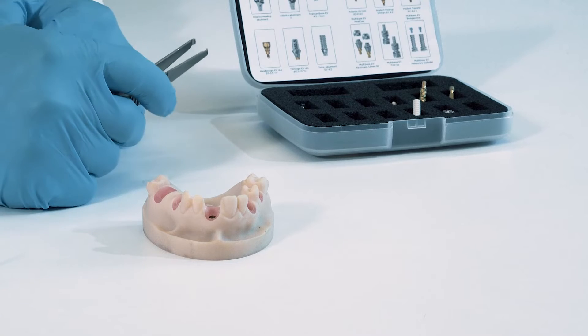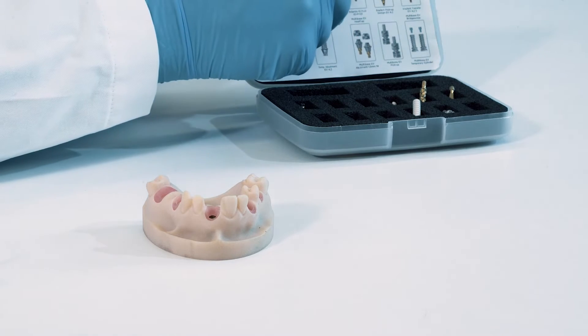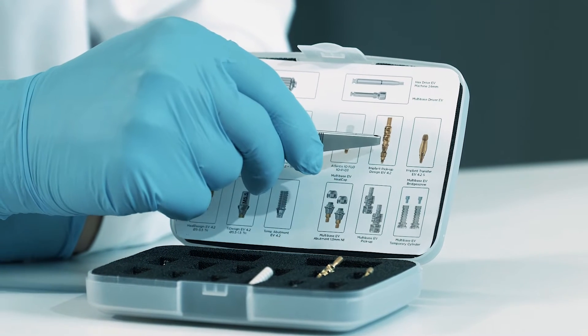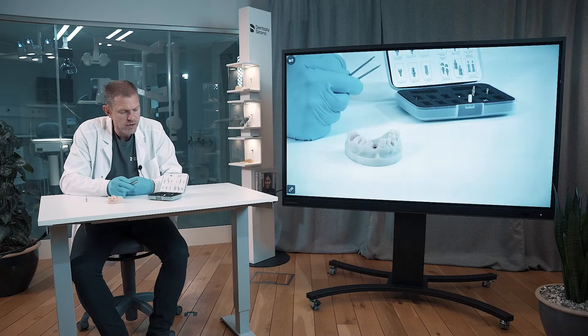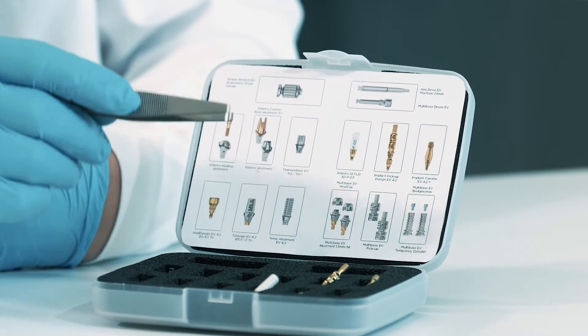The impression components in this box are three and I will show them one by one: the Ioflow, the implant pickup design, and the implant transfer. I will now start to show you the Ioflow.